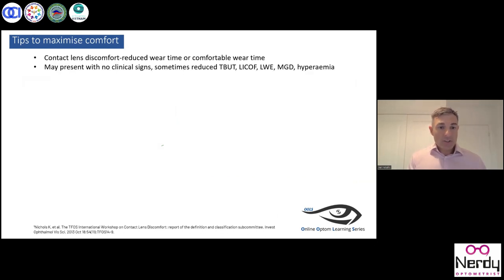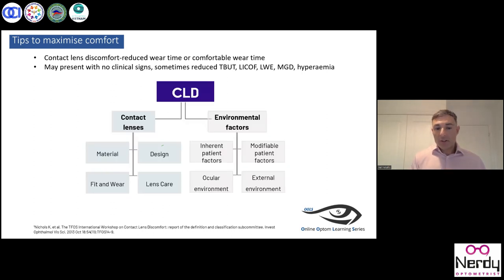So just to finish on this aspect, if we want to maximize comfort as well, one of the things we could do is look to the TFOS contact lens discomfort report, who said there are some contact lens aspects that we could look at, and there are also the environmental aspects. But actually, one thing to bear in mind is with discomfort, there might not actually be any clinical signs. And sometimes there may be changes clinically, but they might be only evident on certain tests and different in different individuals. So we do need to be really observant of our patients.